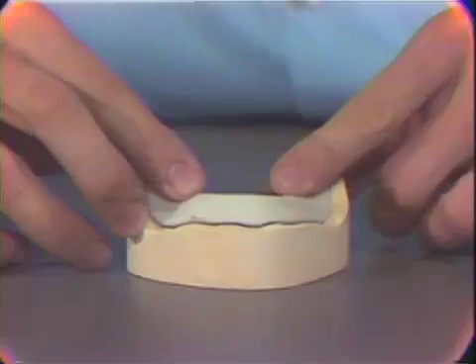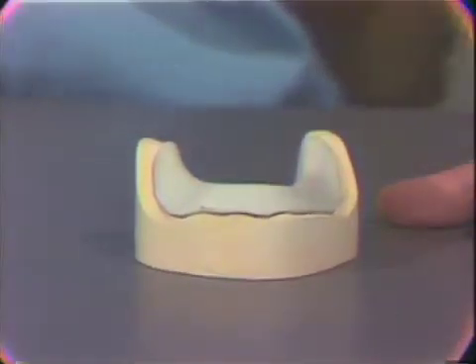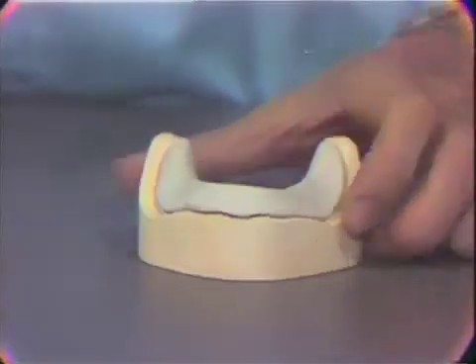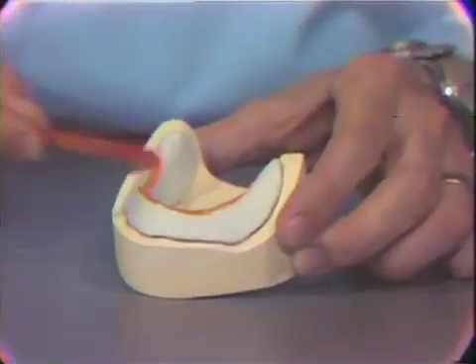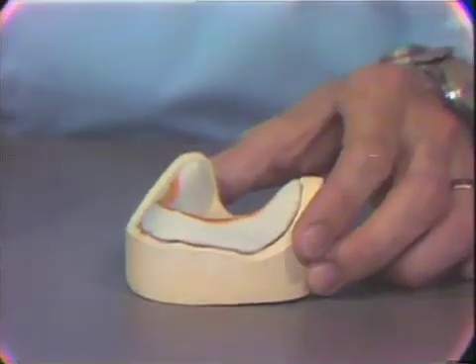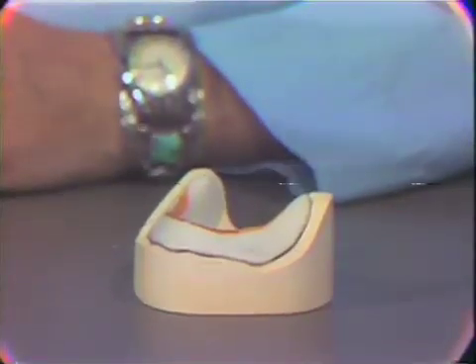The base plate is now placed on our master cast, which was previously cleansed of residual debris and wax. We now paint over the central area of the base plate some yellow sticky wax, because the final treatment to the base plate is the fabrication of a tentative occlusal wax rim. This wax is used to permit the attachment of the pink base plate wax.